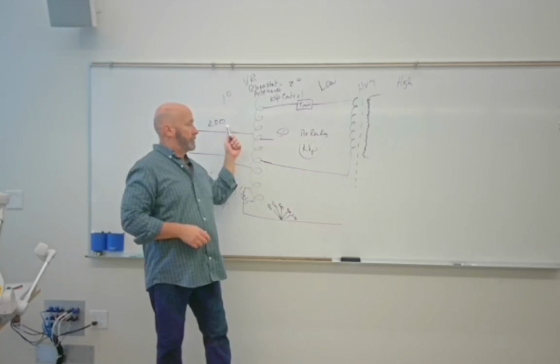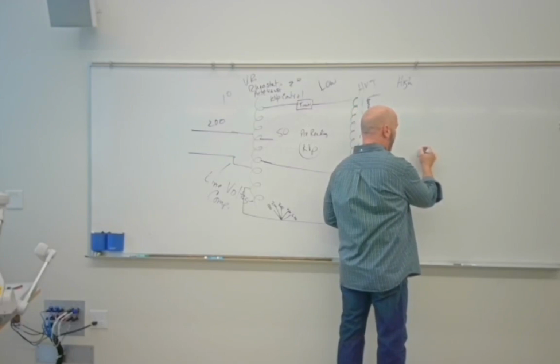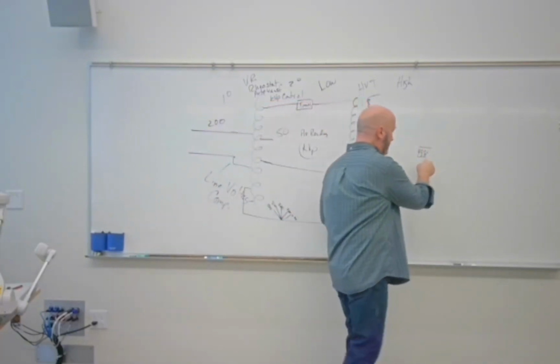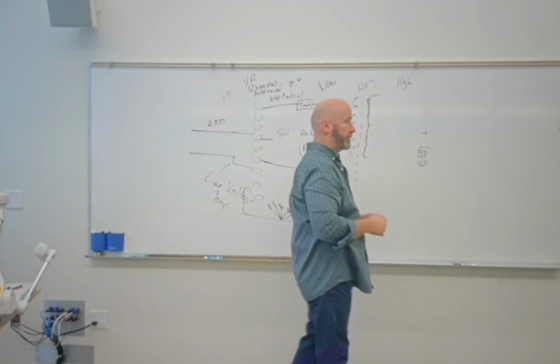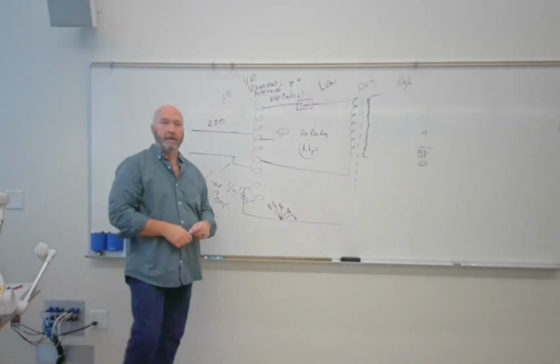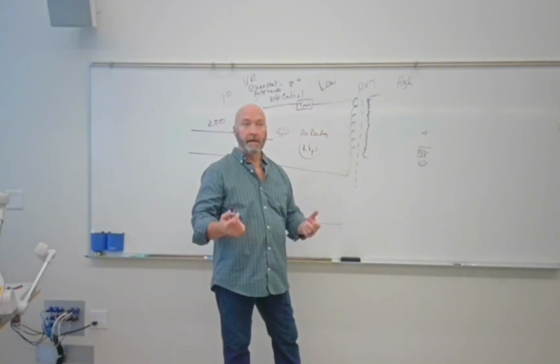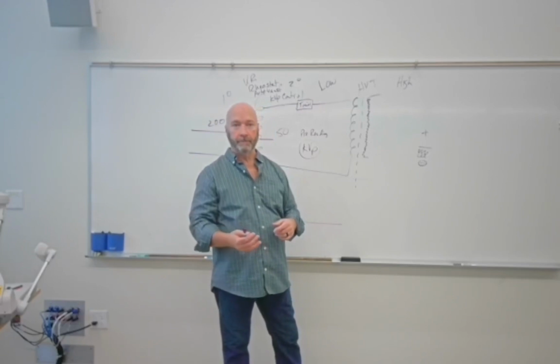So if I have 200 volts and I have a cloud of electrons around a filament, spreading out from the filament, and my anode is right there, and this is negatively charged because of all the electrons, and this is positively charged because of the lack of electrons. Everything that we've talked about in electrification, what would be the tendency of these electrons? Just crowd up more on the filament? Hit the anode. They'd want to jump across, and we don't want that to happen until we're ready for that to happen, right?